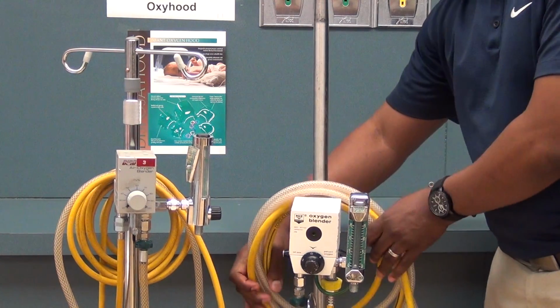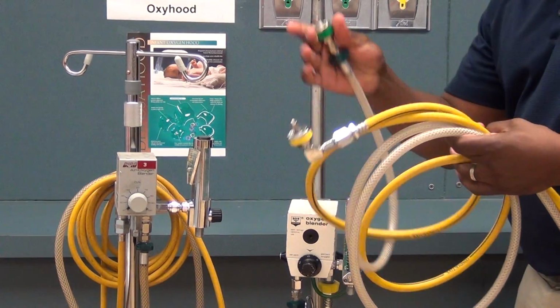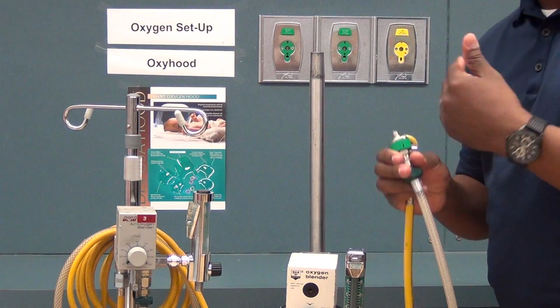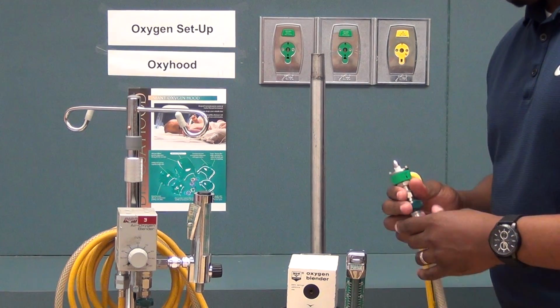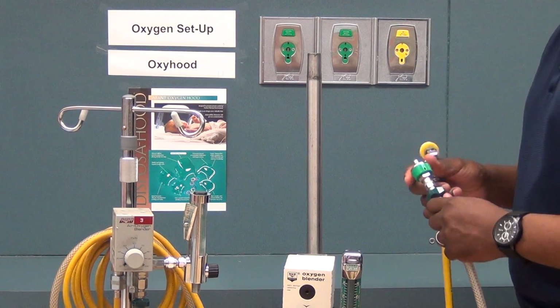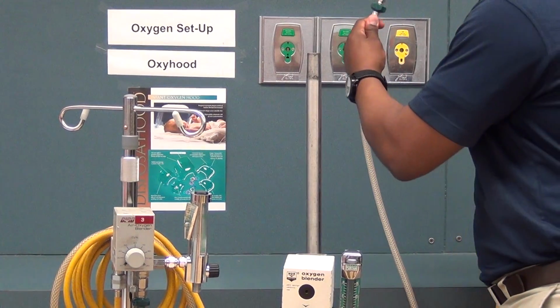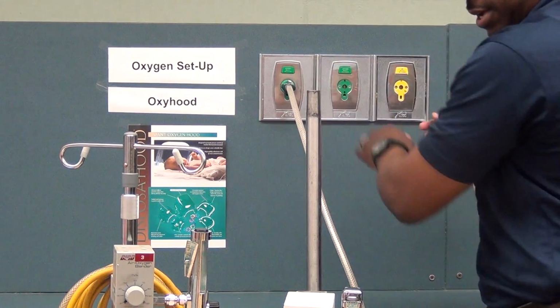To use the blender, you have to plug in the cables. We have oxygen and air. We plug them into the wall, and you'll notice that when I plug in one gas source, you're going to hear a high-pitched sound. That is an internal alarm for the blender to let the clinician know that either a hose is disconnected or the tanks or gas source needs to be changed. So here is our loud pitch noise.